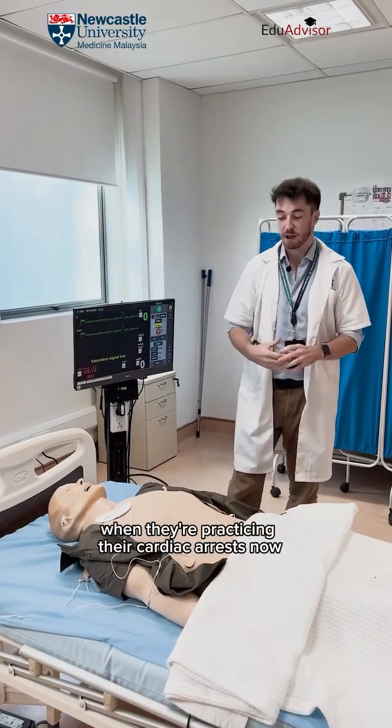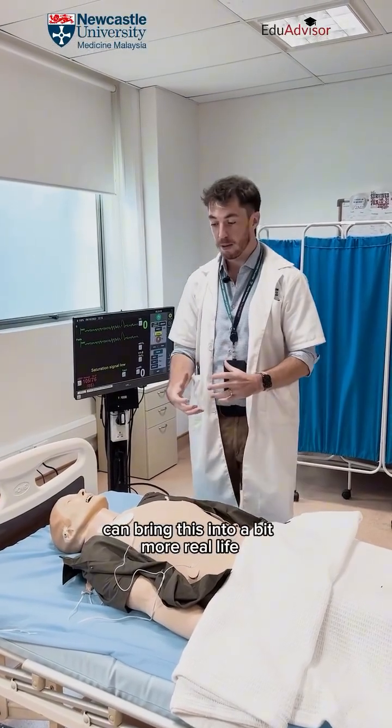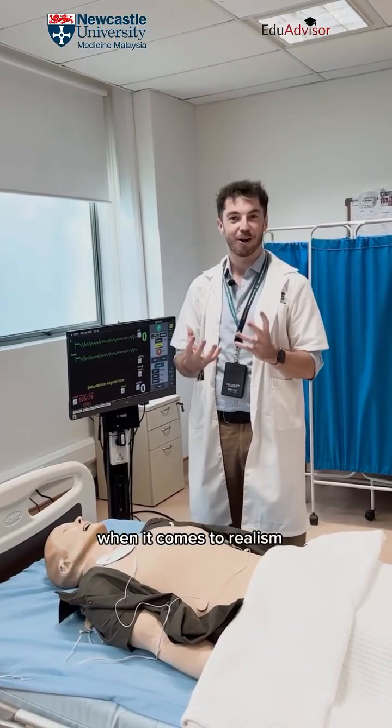The students, when practicing their cardiac arrest scenarios, can bring this into a more real-life setting, moving in the right direction when it comes to realism.